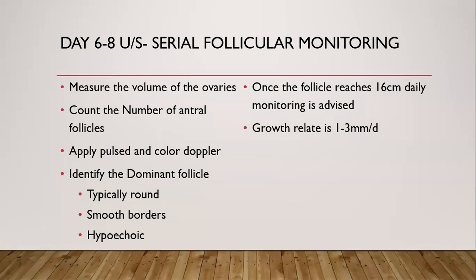As a result, it will grow bigger than the others. And typically, the dominant follicle has the following features. I mentioned earlier on, the shape matters. So this is where indeed you need to take keen interest to identify the type of the follicle in terms of size, shape that you are looking at, to determine whether it is a dominant or it's a false one, false dominant. There are also false dominant ones.